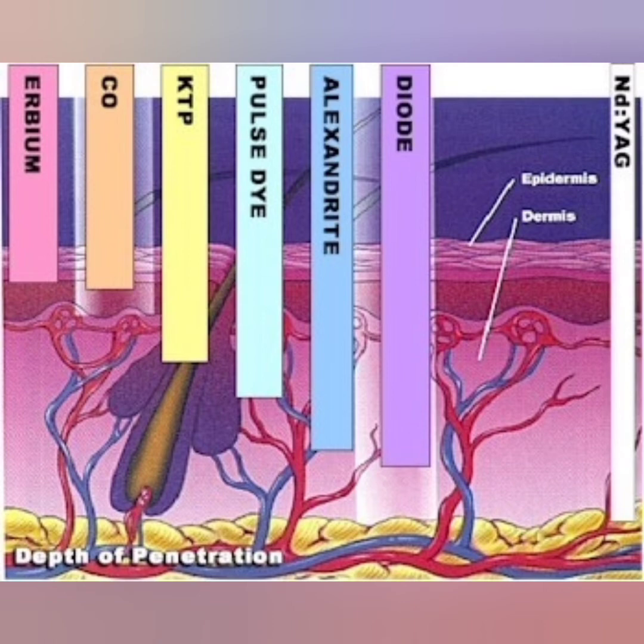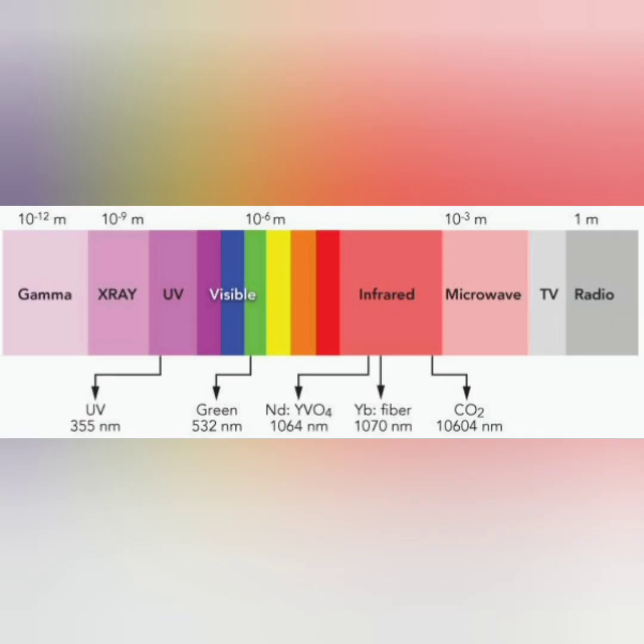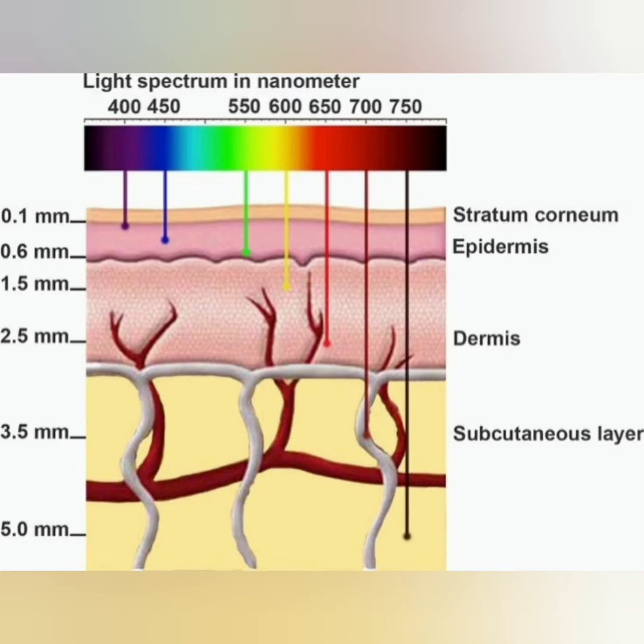So if you don't keep a proper wavelength and settings of energy and pulse duration for Indian skin type, there are chances of laser burns while you do even hair removal treatments. The wider range of possible settings and spectrum of light delivered by pulse light enable the operator a much broader range of possible settings than is available in single or many combinations of lasers.